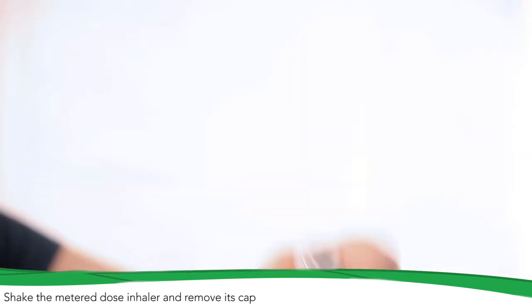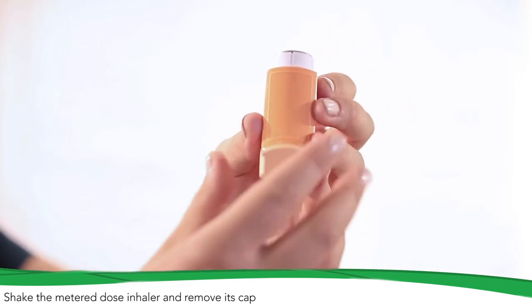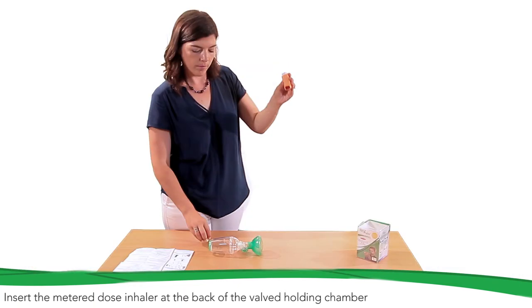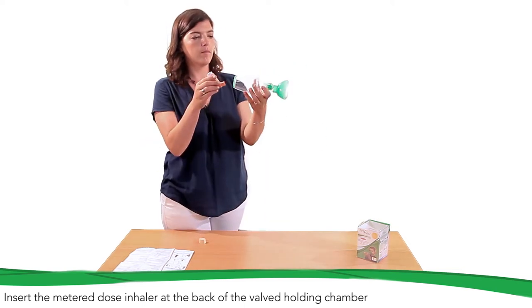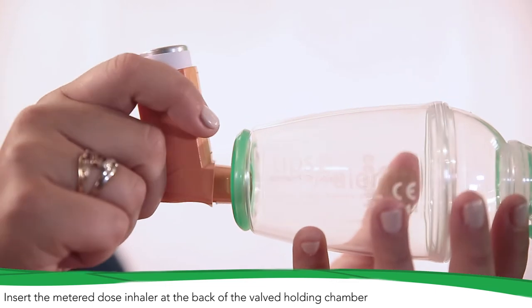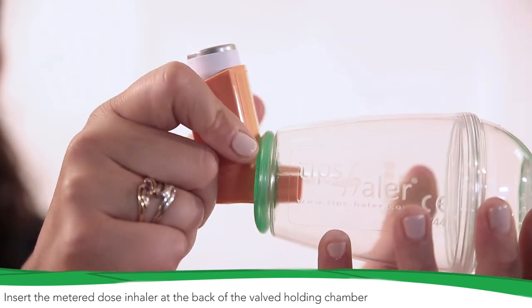Shake the metered dose inhaler, then remove its cap. Insert the metered dose inhaler in the flexible connector at the back of the valved holding chamber. Thanks to its flexible material, TIPS-HALER fits any metered dose inhaler.